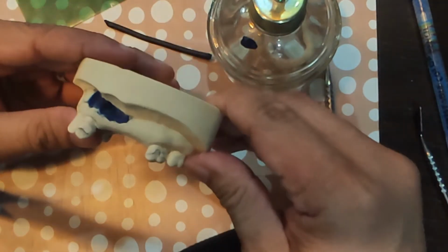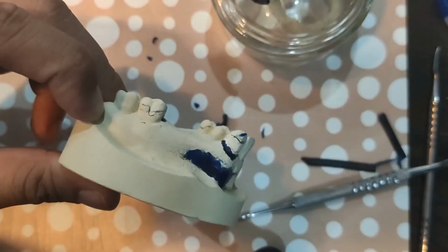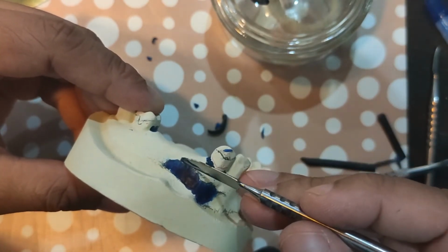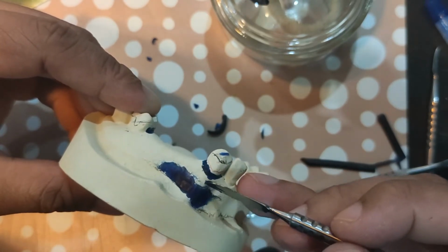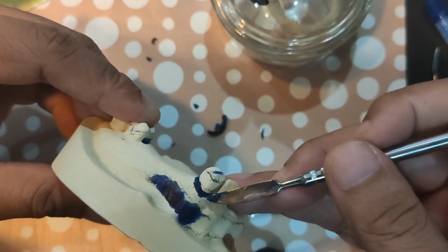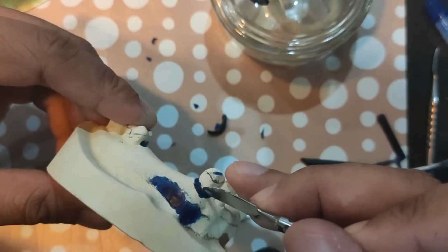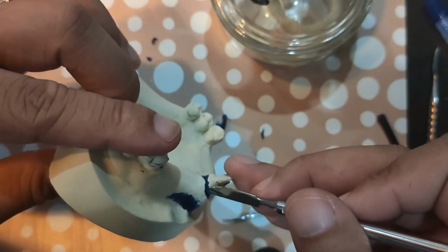Next, we'll be talking about shape blockout. So this is the parallel blockout done. I forgot to mention that there's going to be a gingivally approaching clasp, diba? It's going to go down from the denture base connector, and then it's going to have a vertical approach arm towards the undercut here. So obviously the approach arm, it's rigid, and it's going to cross the undercut where the sulcus is. So you need to block out this area din pala, to protect the sulcus. Right? And the sulcus is protected all around.